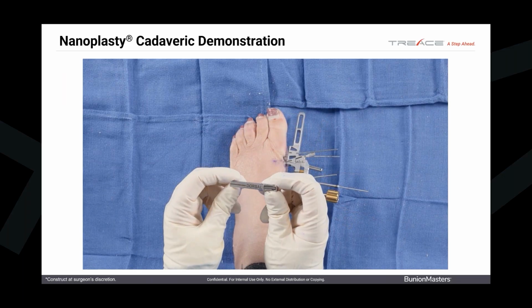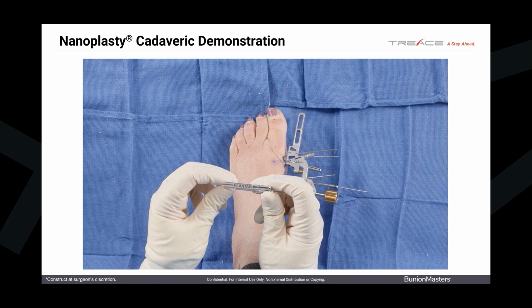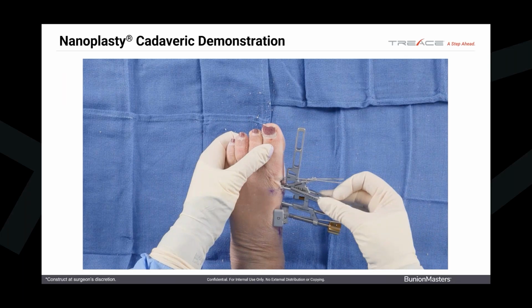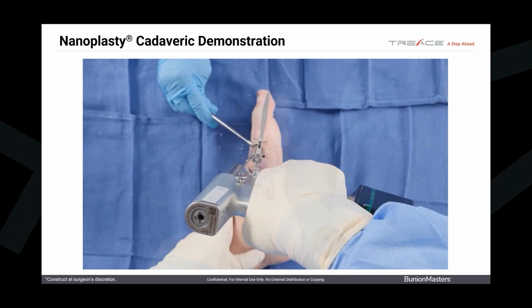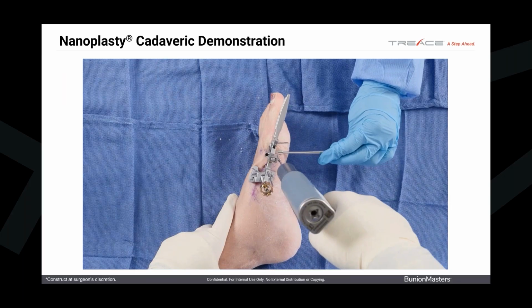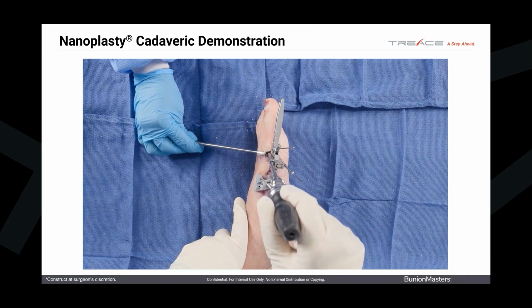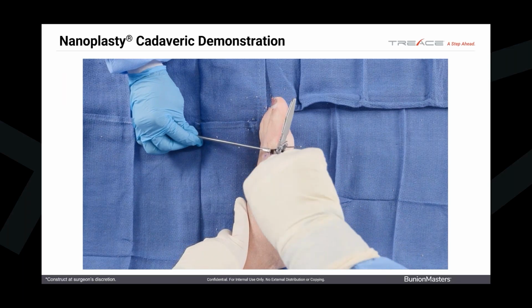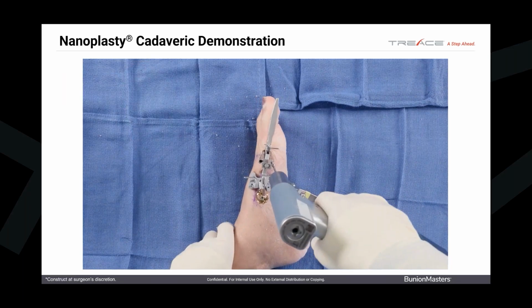We have a screw guide that goes over the post that you can see right on the jig, and they're labeled plantar and dorsal. We're going to go ahead and drill fully down to a stop the dorsal, and then pull the drill out and drill the plantar and leave it in. This is another safe amount of fixation to allow you to crank your screw down on the locking plate and make sure nothing rotates. These are locking screws, so don't fall short of seating them.